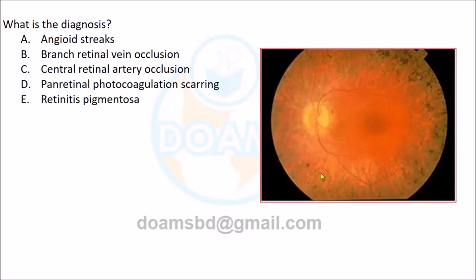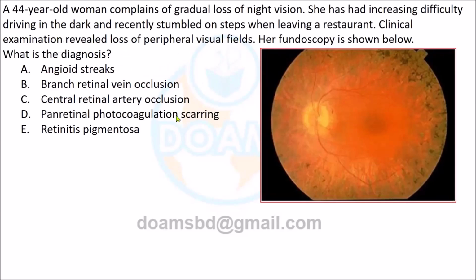About the disc, how does it look? Sir, it has clear margins. The margin is clear, but the color appearance is normal. Yes, that is the thing. I told you that somebody will say normal, somebody not. Anyway, this is the description of the patient. It may be a case in the OSCE or any other clinical exam in the world, even in the PACES exam, in the postgraduate fundoscopy station. It's a very nice picture, not very common.